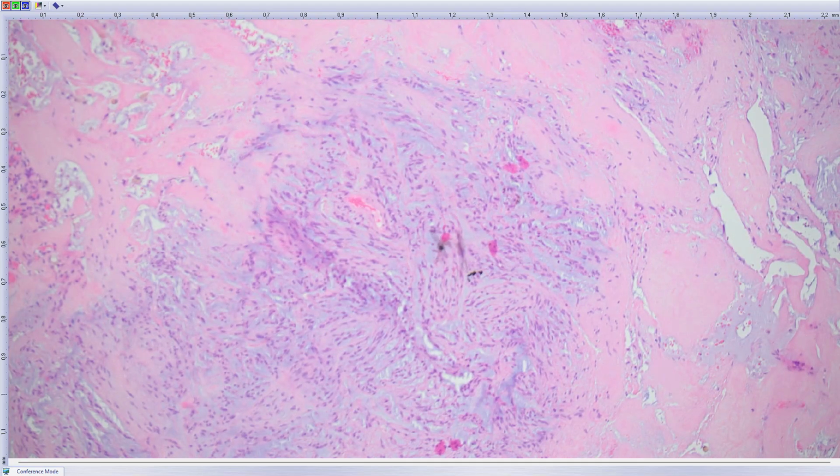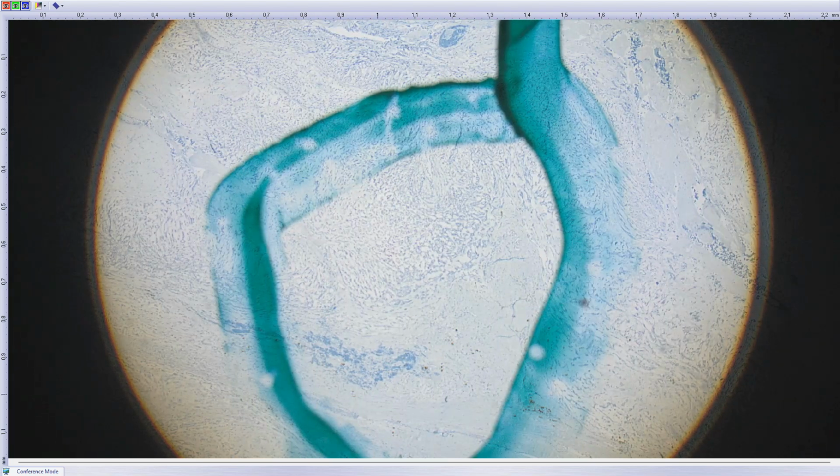About 1/3 to 1/2 of cases express neuroendocrine markers such as INSM1. This is INSM1, very poor expression in this case, not very helpful. Some cases express S100 protein. Basically, the only key to diagnosis is morphology, and if it's highly suggestive, just add FISH for NR4A3. So this case had the translocation by FISH, and it was extraskeletal myxoid chondrosarcoma.